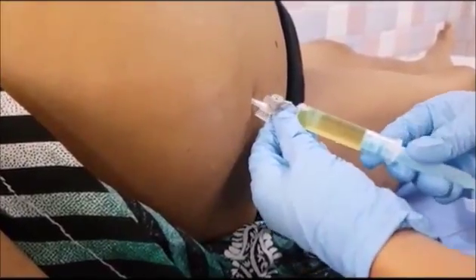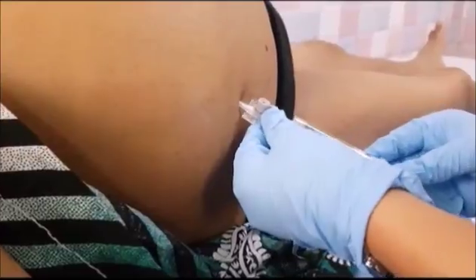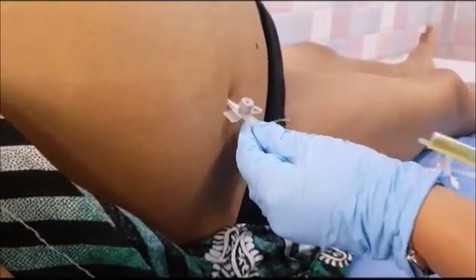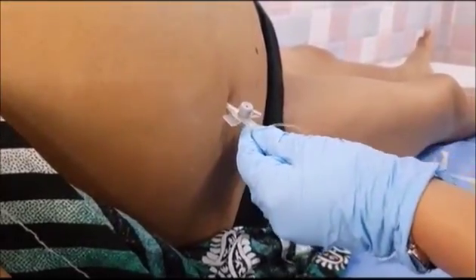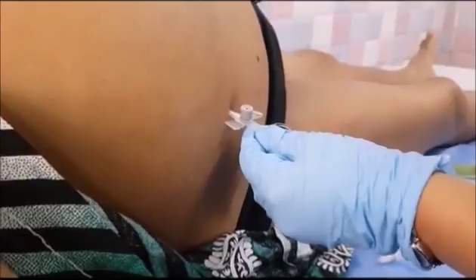We will take one more syringe. This is the diagnostic ascitic tap. This is finished if we wanted to do a diagnostic tap.